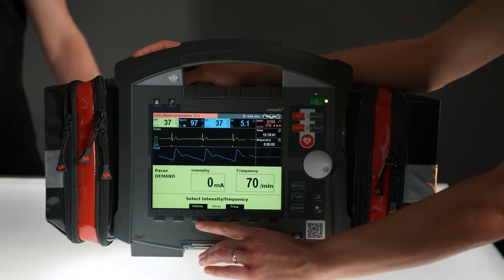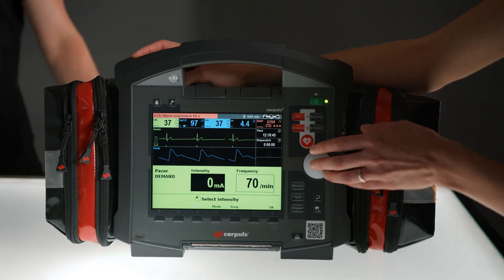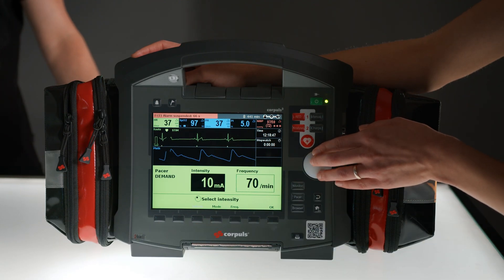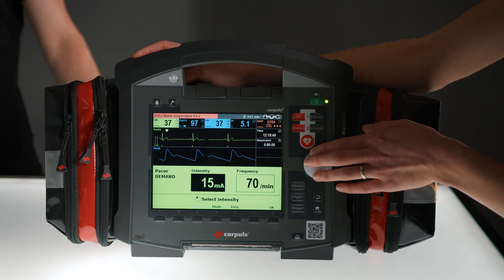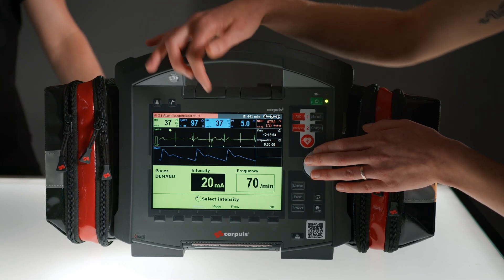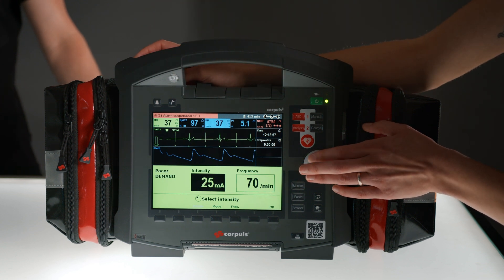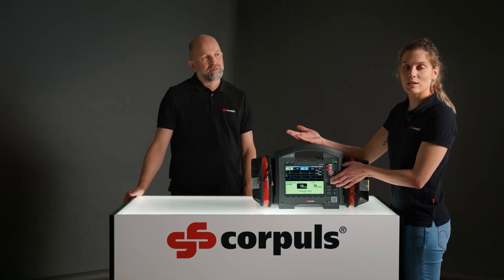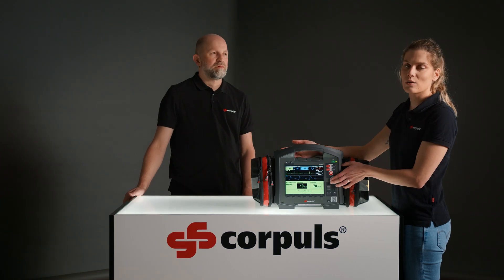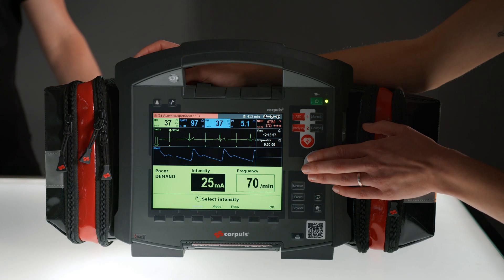To change the intensity, I select the intensity soft key and I can adjust it using the jog dial. As soon as I do this, the device will automatically start the therapy. You can see here at the top that we now have the PACER spikes marked with a diamond. Whether we start from the top or from the bottom is locally variable — please refer to your own standards. We will start from the bottom now.